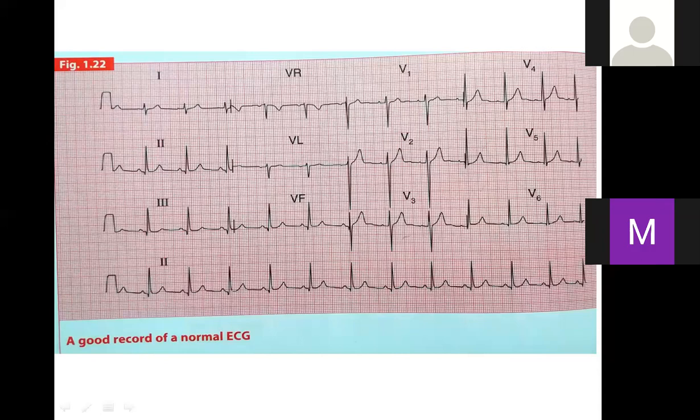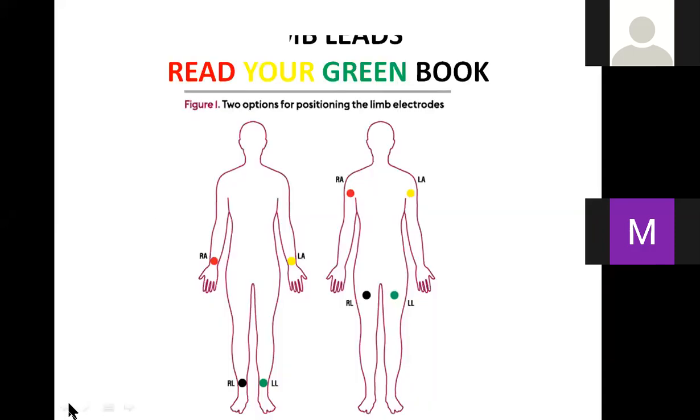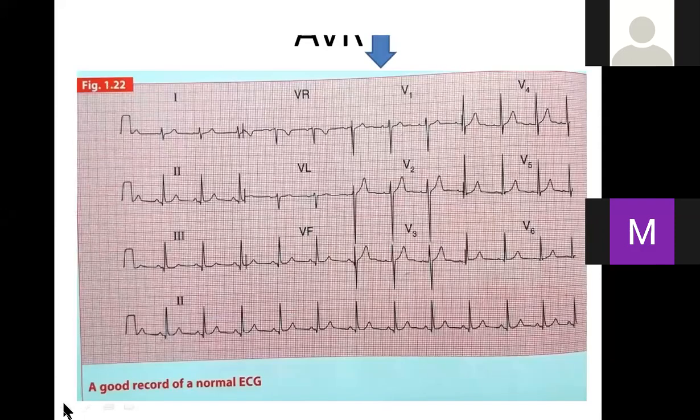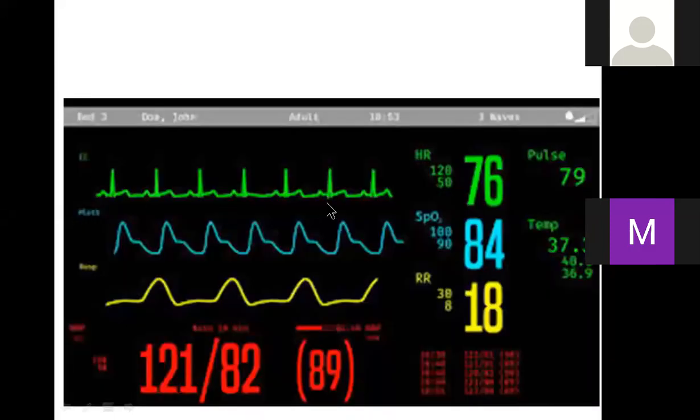So we come to the first point of Saqib's 14 points for reading ECG. The first point is AVR. In the operation theater, you are looking at this tracing on the cardiac monitor, and in this you will not be able to see some of the abnormalities.